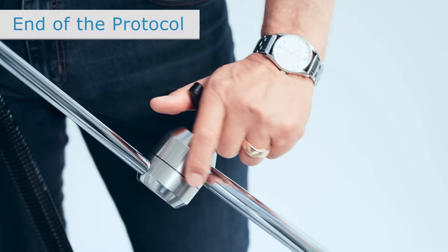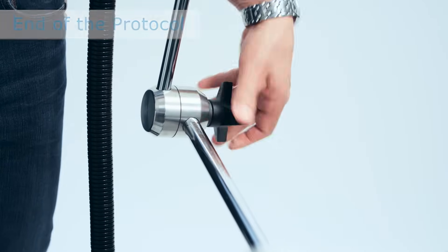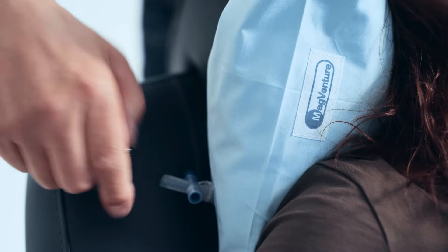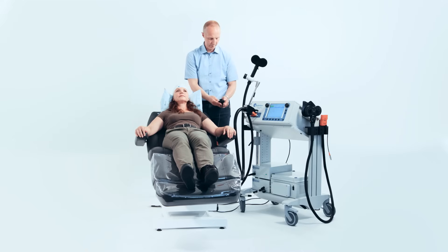When the protocol has reached completion, remove the coil from the patient's head by loosening the joints in the articulated flex arm and moving the coil away from the patient. Release the vacuum from the pillow by disconnecting the tube connecting it to its pump and opening the valve. Re-adjust the chair to allow the patient to get off of it without difficulty.